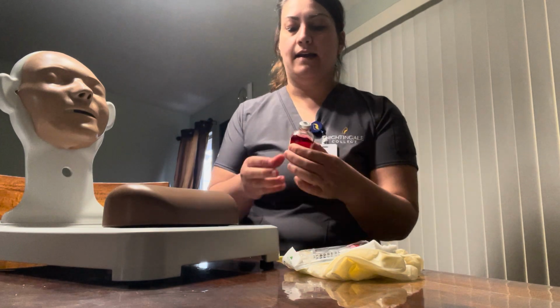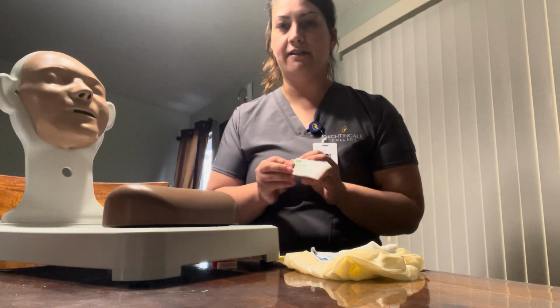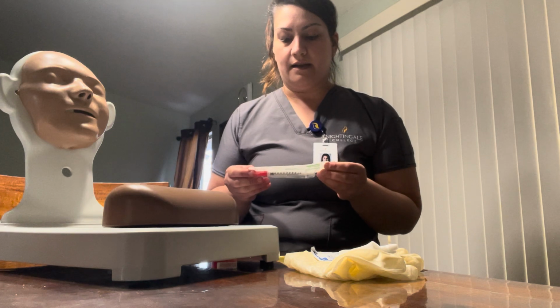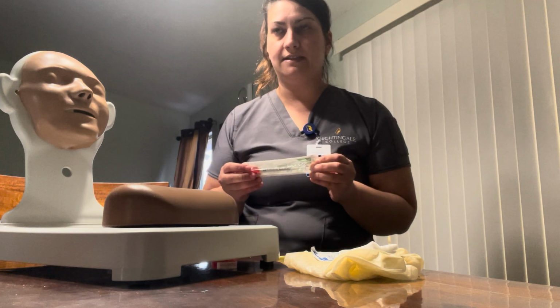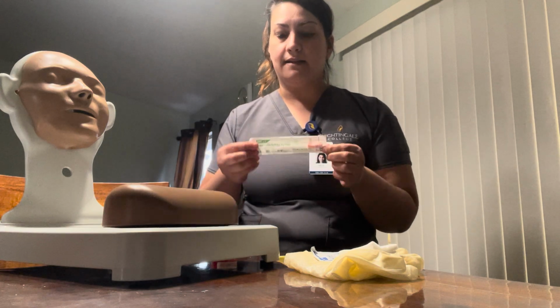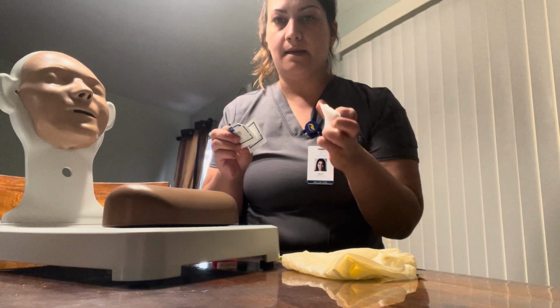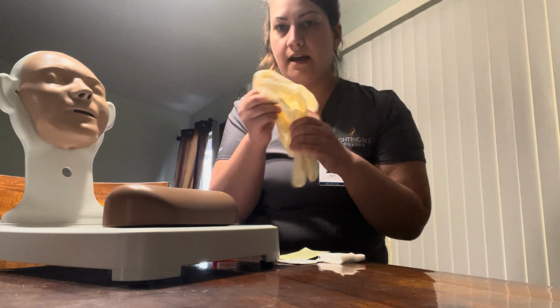I'm going to have my vial, my medication vial. I'm going to have my syringe, which in this case should be a 25 to 27 gauge needle. It's going to be a 1 to 3 mL syringe, with a 5/8 to 3/8 inch needle. And in this case, we're going to be using the one that's in my kit. I also will have my 2 alcohol wipes and my gauze that I can wipe with later. I have my gloves.